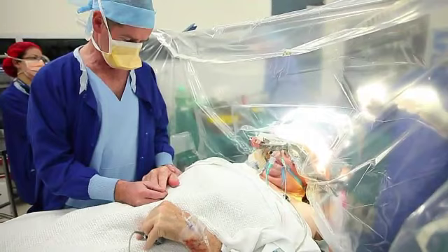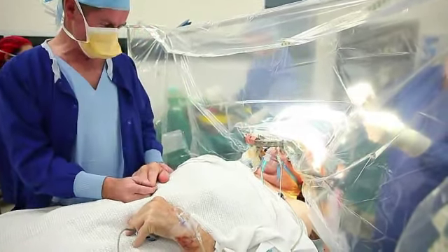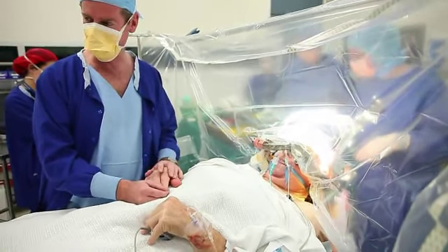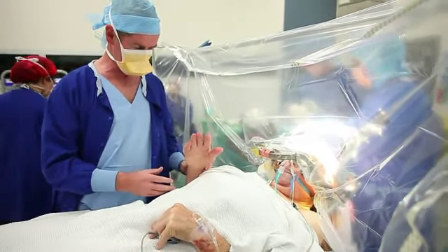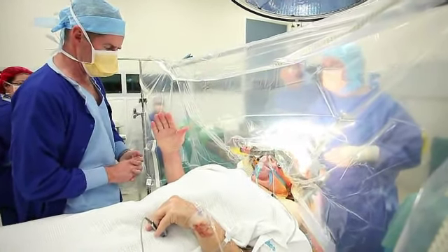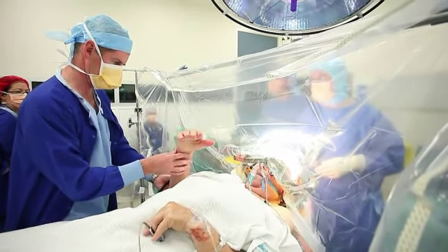There are a number of other people in the operating theatre — this is a team effort. We work with a neurologist who is monitoring the patient at the other end of the table, examining the patient fairly continuously throughout the operation and interpreting the signals that we're getting from the brain recordings. Once we've seen what those signals are and what happens when we stimulate through the wire, we generally make a joint decision about where we're going to put the electrode, and sometimes that decision may come about after looking at several different areas in the brain.